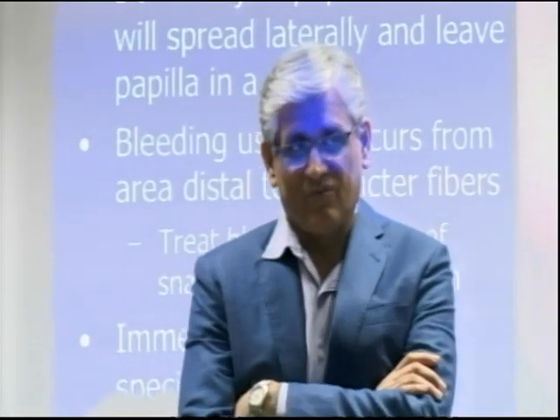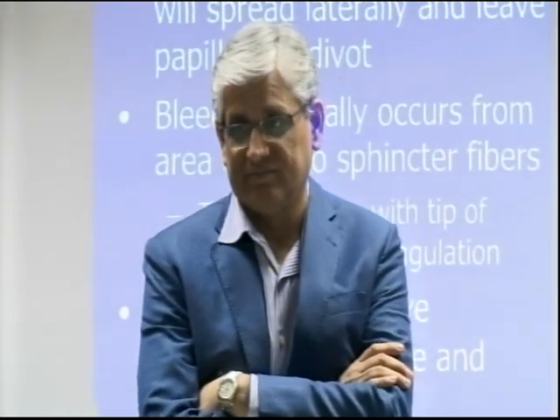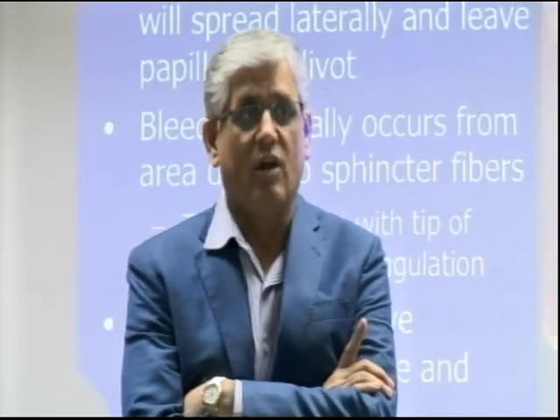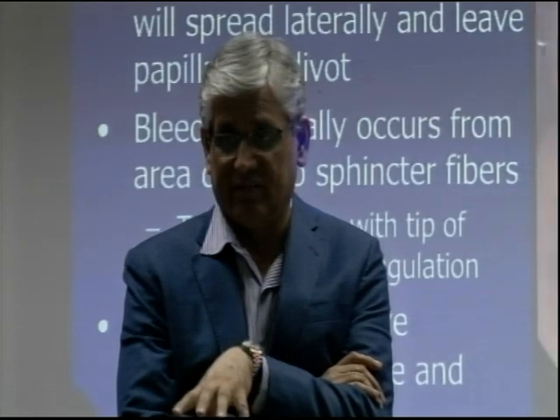I think one of the things that comes out very clear from this course is we've had some stent exchanges, maybe 3 cases, so 10% nikal dein. So we are now at 141 cases. We have 0 failure. Today, in front of you, 16 cases, 0 needle knife. And they were not the easiest of the papillas either. They were not all very floppy, simple papillas. There were all sorts of cases that you've seen. But each case we were able to cannulate.